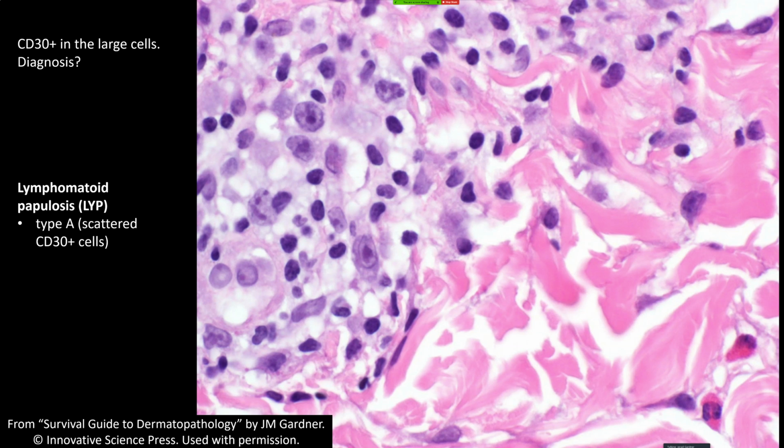Number two is we split things because there's a difference in the microscopic pattern, and we make a point of saying, oh, this is this weird subtype of entity X, to make sure the pathologist remembers, oh yeah, this one looks different, but is actually the same thing, right? And so that's kind of where we are.